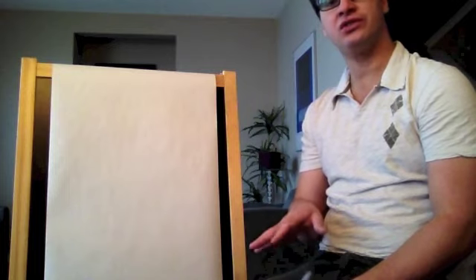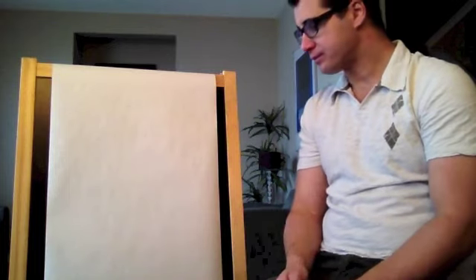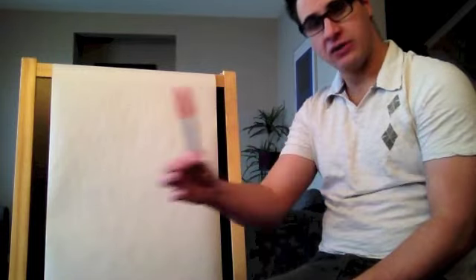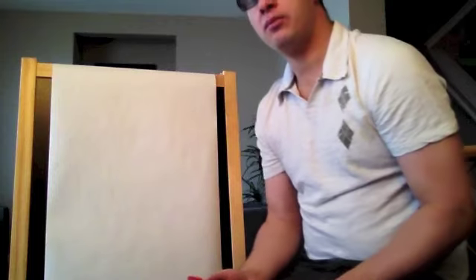So first we'll understand what an ECG is. Basically it's a machine that reads the way electricity goes at a certain speed. What's really important to understand is that it's one picture in time. If we make a comparison, when we put someone on a monitor, it's like a video camera.